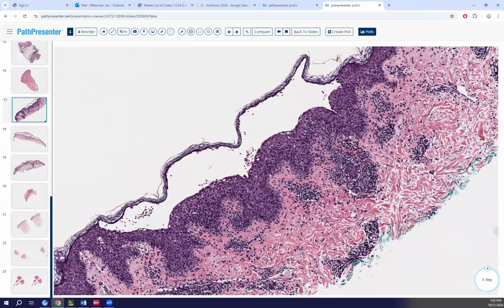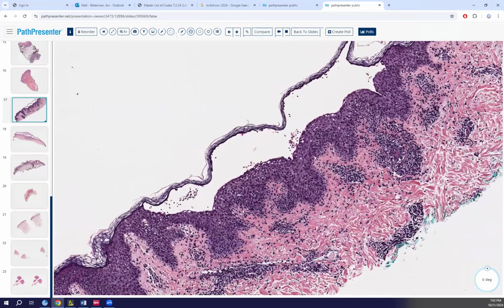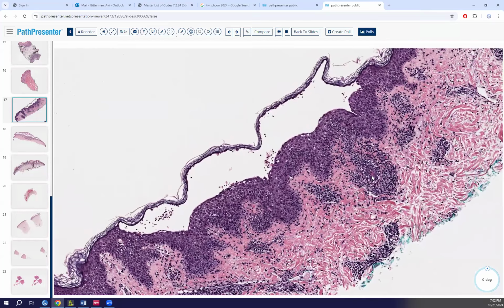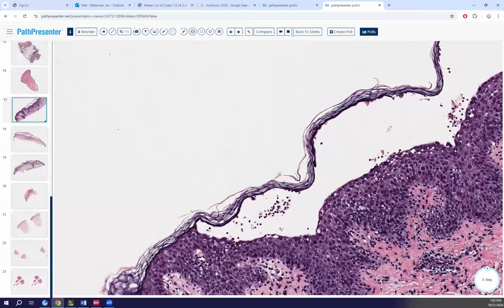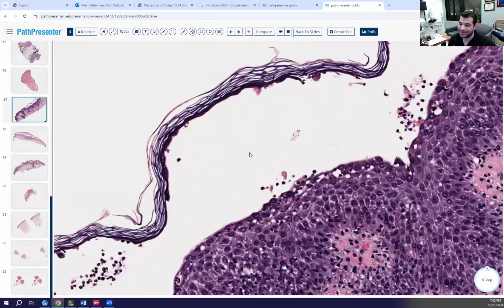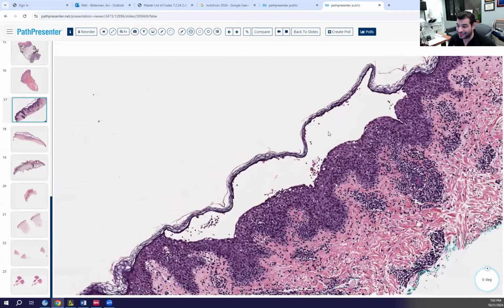So what are we thinking? Pemphigus foliaceus. Pemphigus foliaceus should be the top of your differential with this pattern. Not the only thing it could be, but yes. Do you usually not see that much material within a blister, or is that not reliable? Classically, this is a classic example of what I would take to be pemphigus foliaceus.